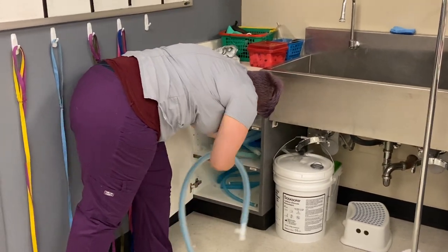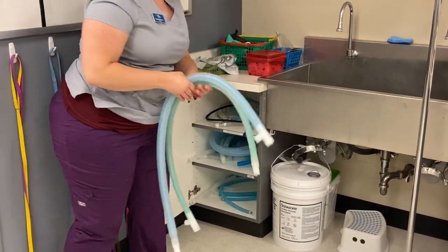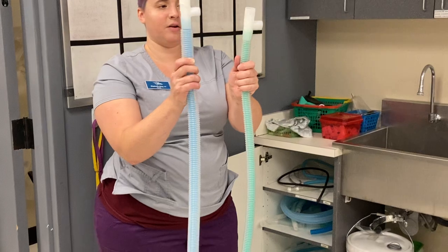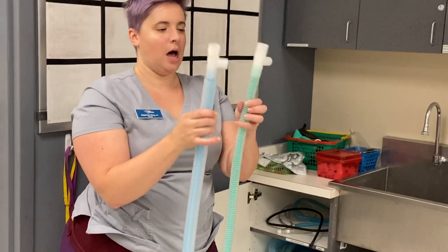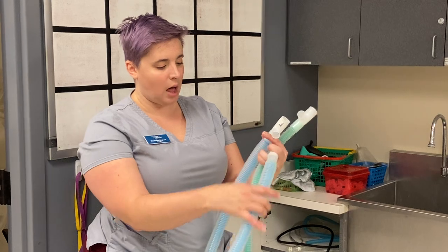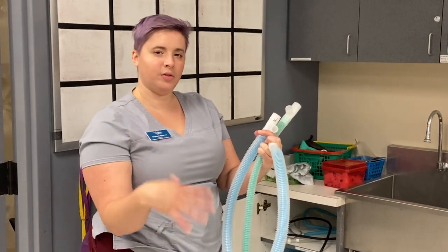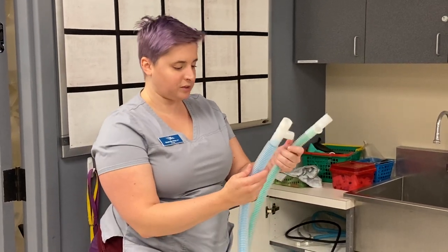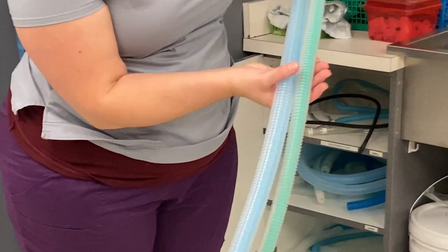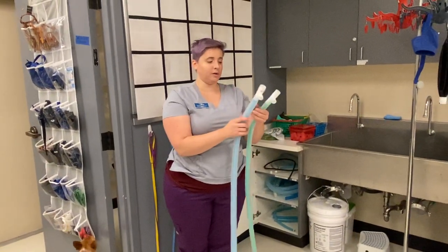As far as rebreathing circuits go, I'm going to show you a couple. What we use here are known as F circuits — I remember that because they actually kind of look like an F. These are nice because they have a tube inside of a tube. They're better than the Y circuit because as the animal exhales, it helps to continue warming the air going in, so they don't get cold air. There are two different diameters — green is for smaller patients on a rebreathing circuit and blue is for larger patients.